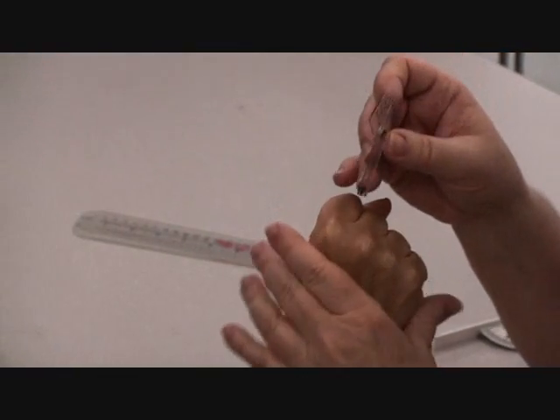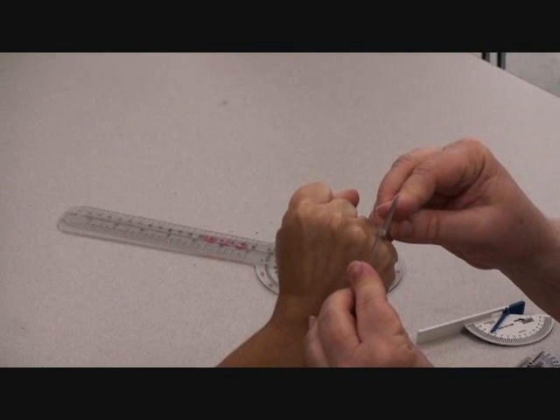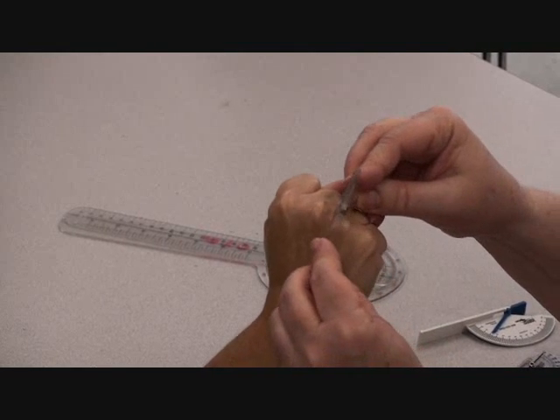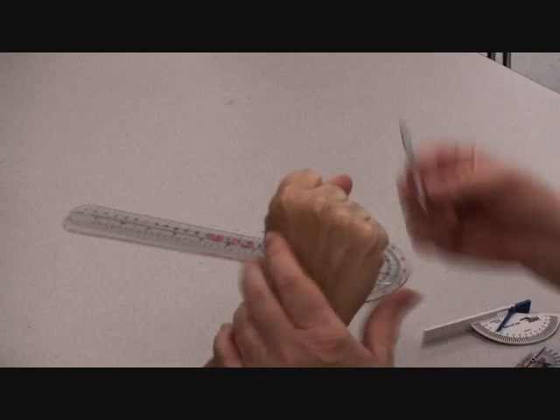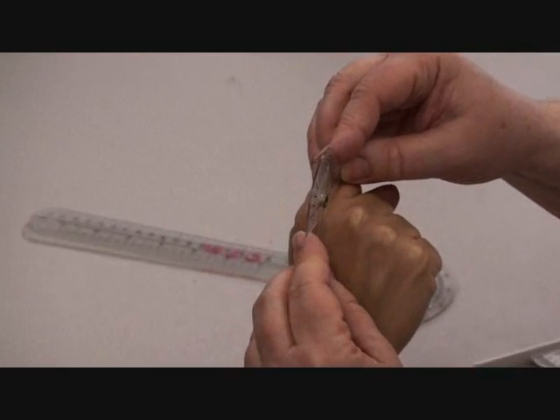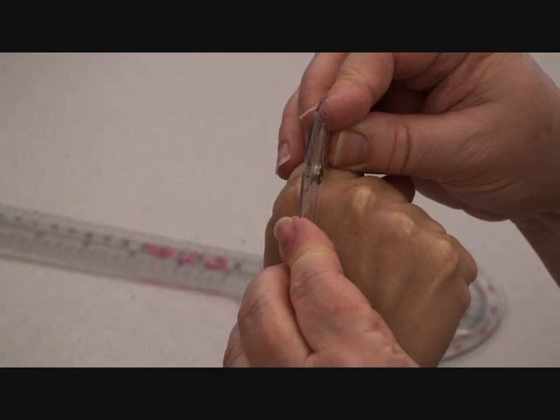So can I show you your fist again? So MPs, you can go over the top. If I'm here on the small finger, not a big deal. But if we're on the index or middle finger, if you're going to use the over-the-top method, I would come off to the side. So let's just see what difference we're getting here.